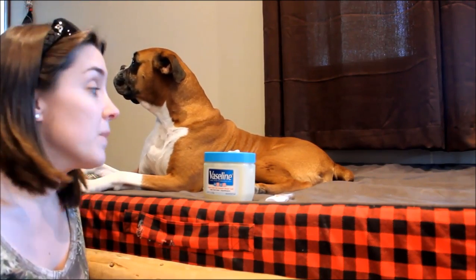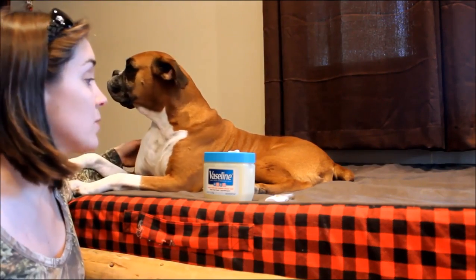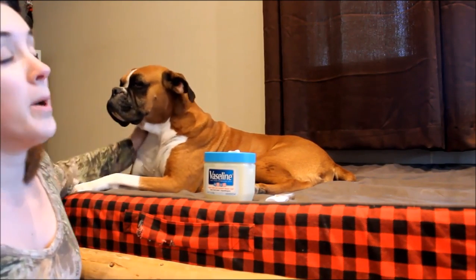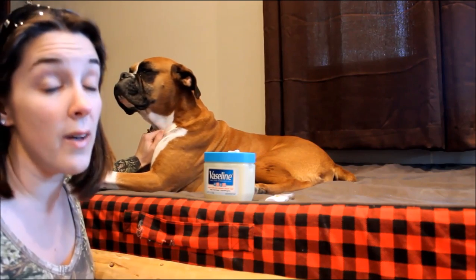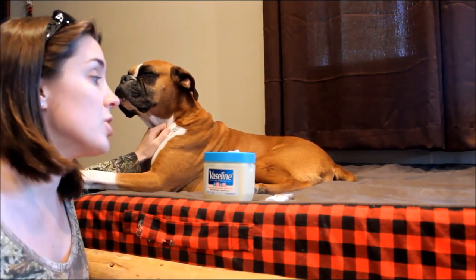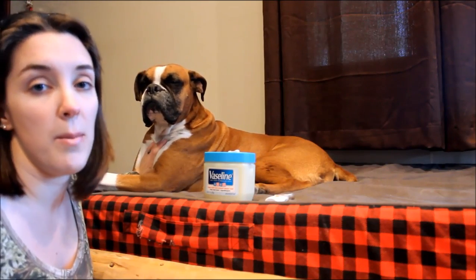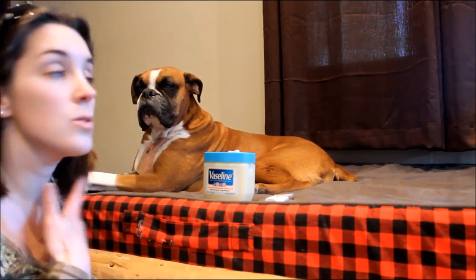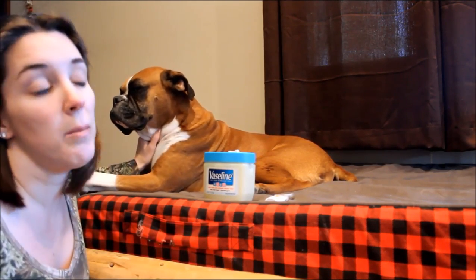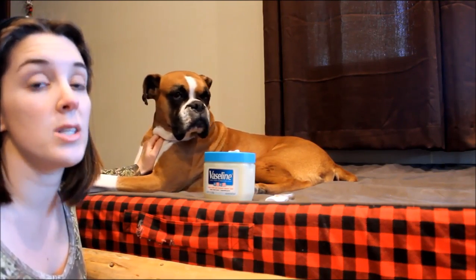You obviously need your dog, and you want your dog to be relaxed — that's why Chloe's here on her bed laying down. Chloe is very used to this; she has a heart condition so we go to the vet frequently and I've done this to her many times, so she won't put up a fight. If it's your dog's first time or you think they might be a little squirmy or fidgety, just ask somebody else to help hold their head and pet them to calm them down.